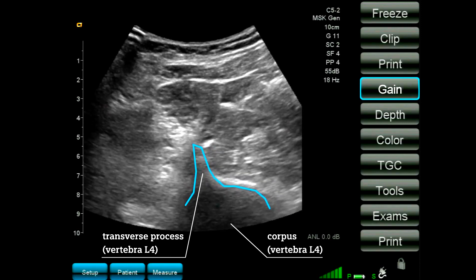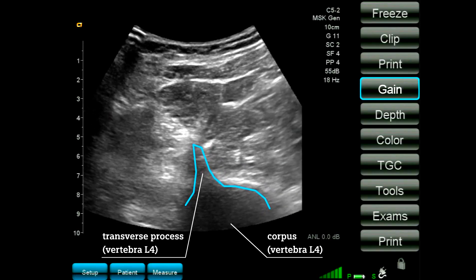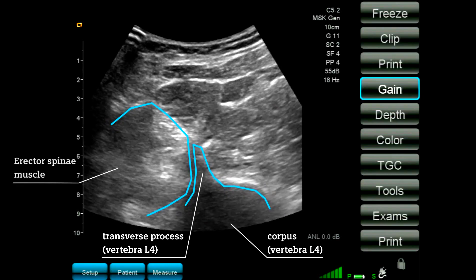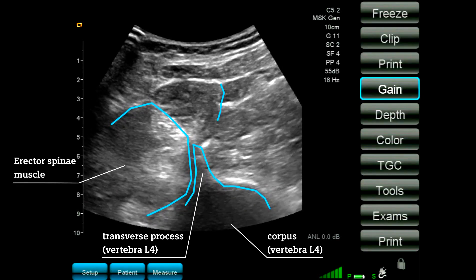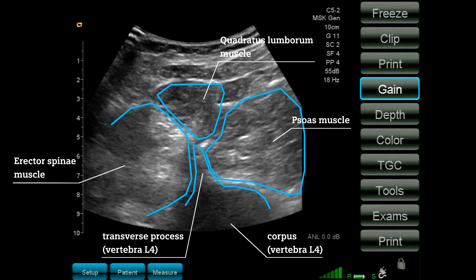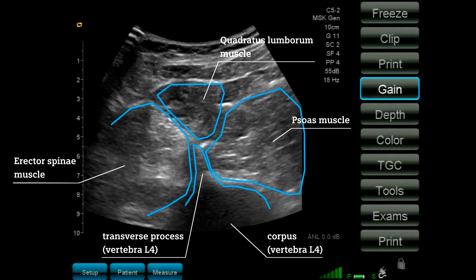We can see three muscles surrounding the transverse process. On the posterior side, on the left side in the ultrasound image, we see the erector spinae muscle. On top of the transverse process we see the quadratus lumborum. And anteriorly, on the right side of our ultrasound image, we see the psoas muscle.